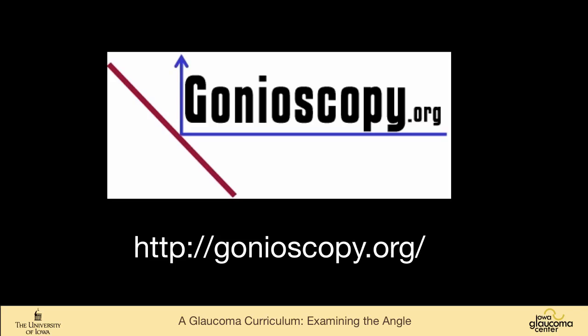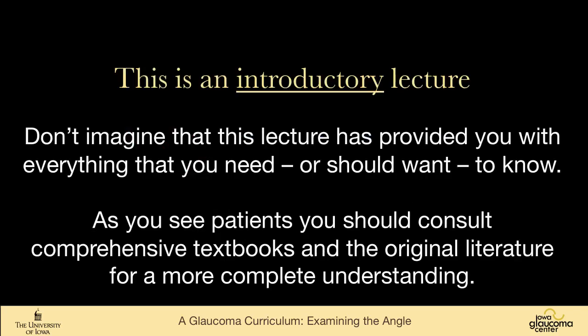not just to determine angular width, but to determine pigmentation, neovascularization, all sorts of things that OCT and biomicroscopy can't show you. I do have a website, gonioscopy.org, that has lots of examples of gonioscopy techniques and findings. So an overview of examining the angle. Really something that's hard for first-year residents, but it's a critical tool.